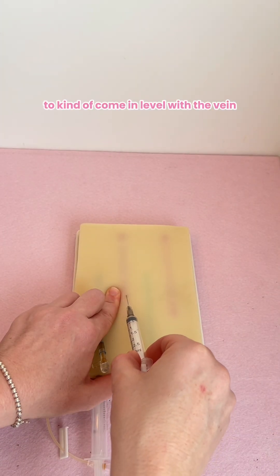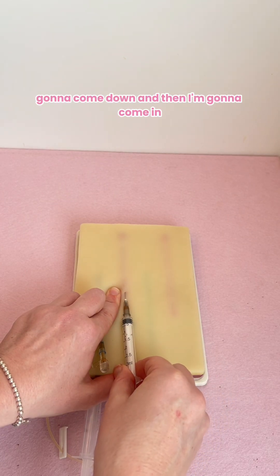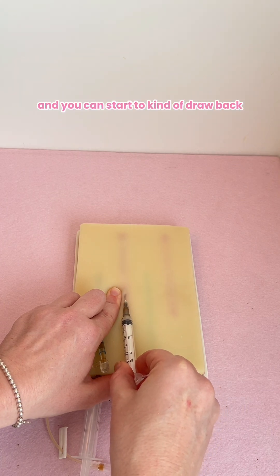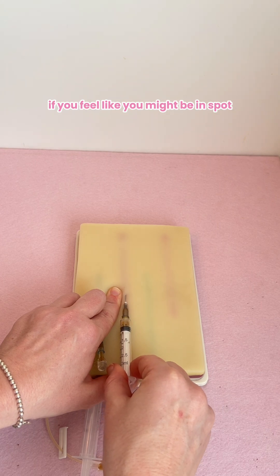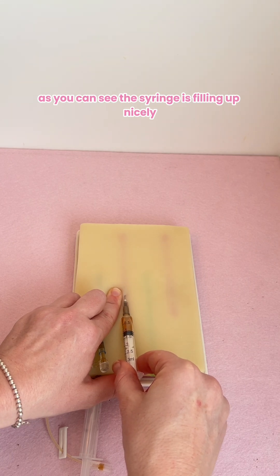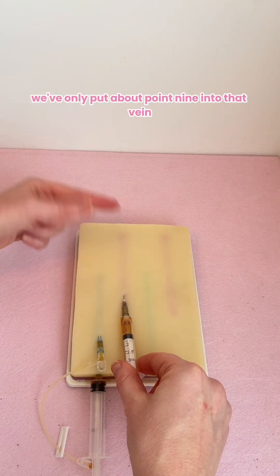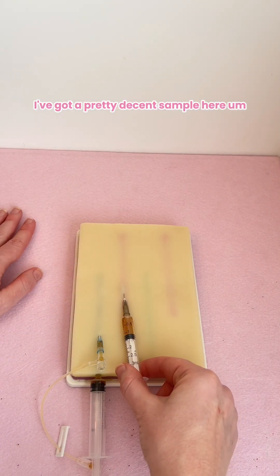Come in level with the vein — come down and then come in. You can start to kind of draw back if you feel like you might be in the right spot. With this one, we have been successful — as you can see the syringe is filling up nicely, actually taking our blood sample. Remembering that we've only put about 0.9 into that vein, but as you can see I've got a pretty decent sample here.